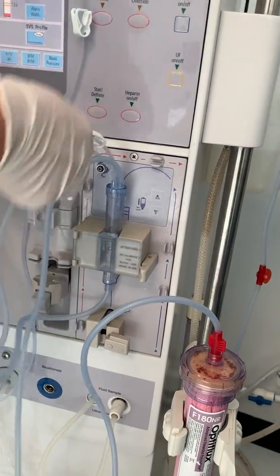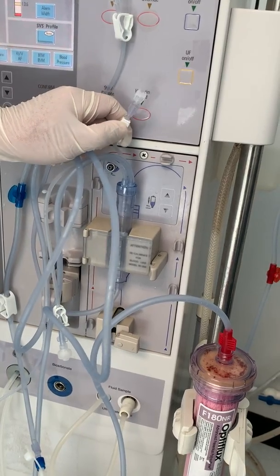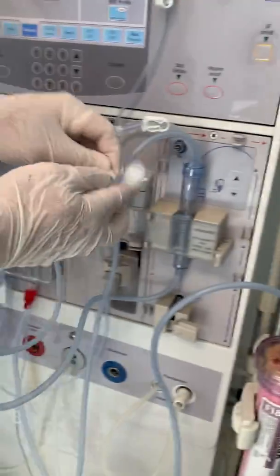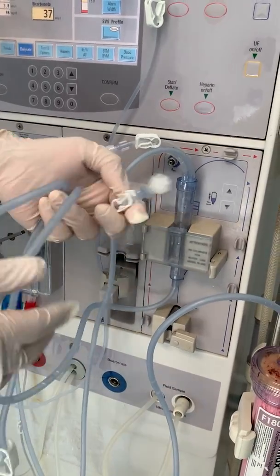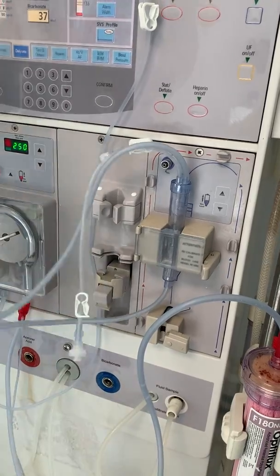On this chamber, you have two of these lines right here. You always want to clamp this — make sure this is tight. You always want to clamp this — make sure this is tight. And after that, same thing that we did on the arterial side.